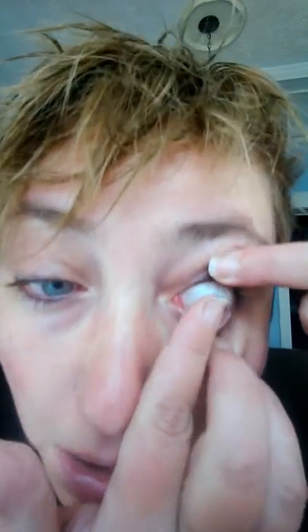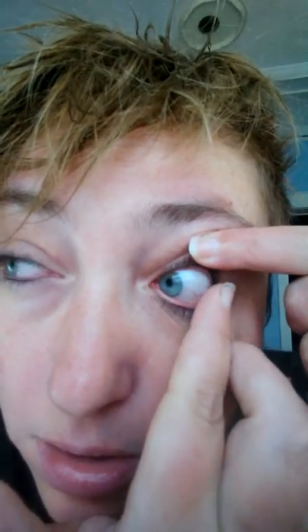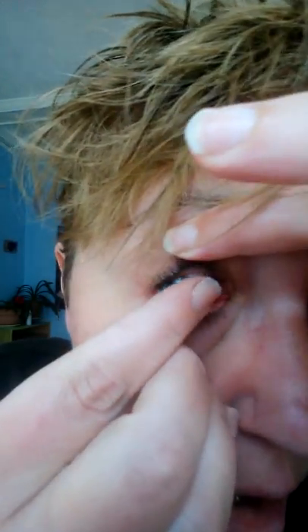Hi! Putting contact lenses in is actually very easy and you don't need to be afraid at all. Some people are nervous because you get things in your eyes, and other people are nervous because you're going to touch your eyes, but it's actually easy to touch your eye — it doesn't feel like anything, so you should practice with that.